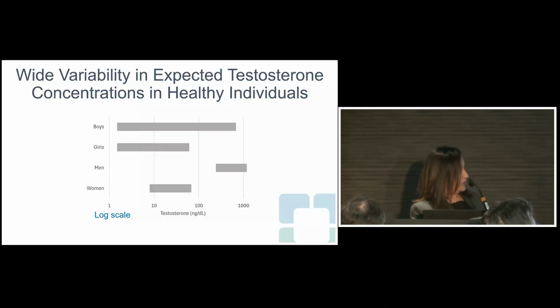And this is important in terms of the assays that we want to use to measure, and the robustness of the assays, and what we need at low concentrations and so on. So notice here that we are aiming at concentrations close to 1 nanograms per deciliter to meet the need of measuring testosterone in pediatric patients.